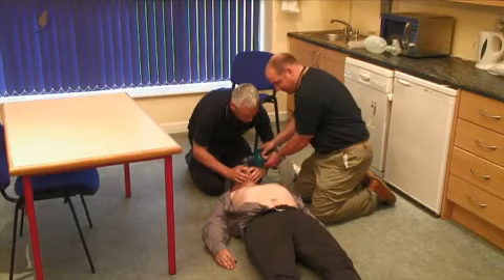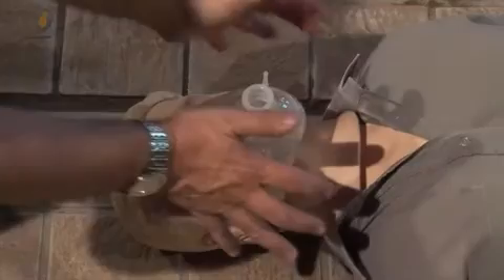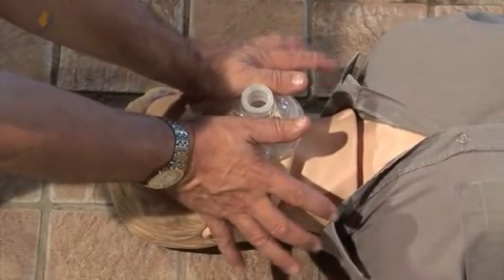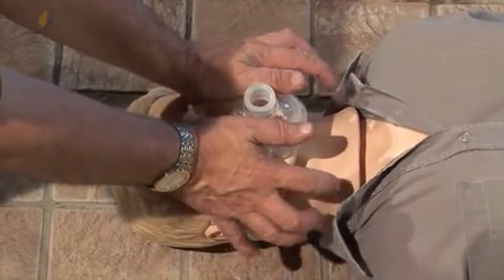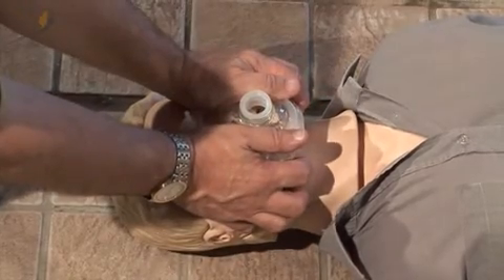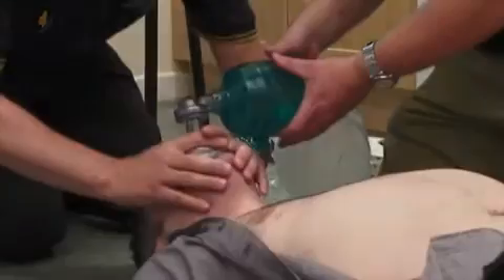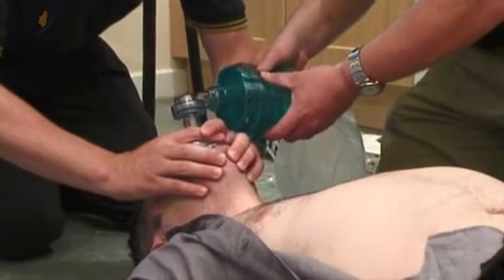If a second person is used, the mask is sealed by placing the thumbs of both hands of the first practitioner along the side borders of the mask. Then place the fingers of both hands underneath the jaw, pulling upward. The bag is squeezed by the second practitioner.